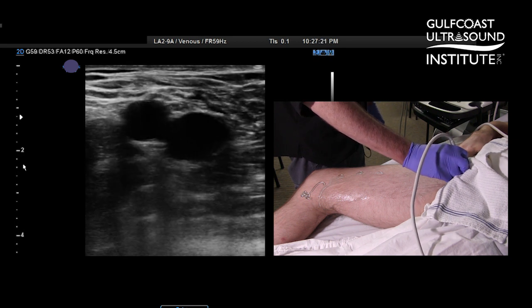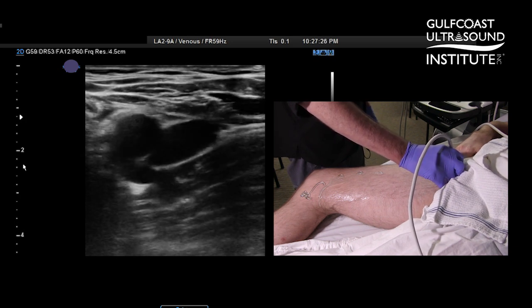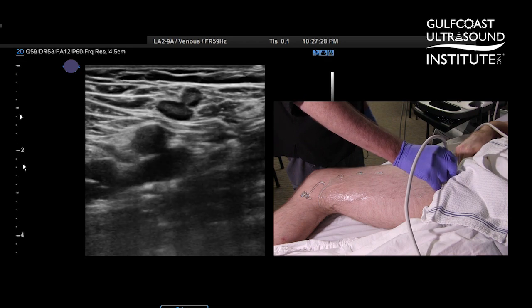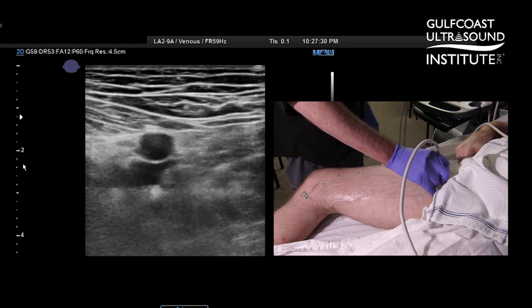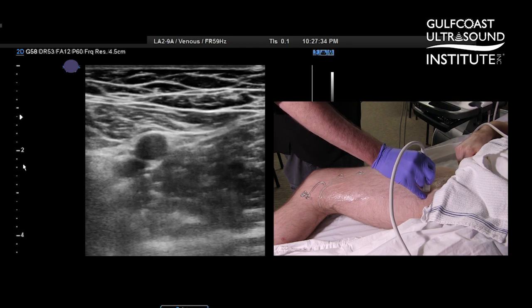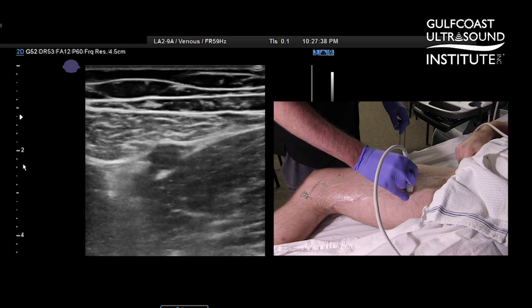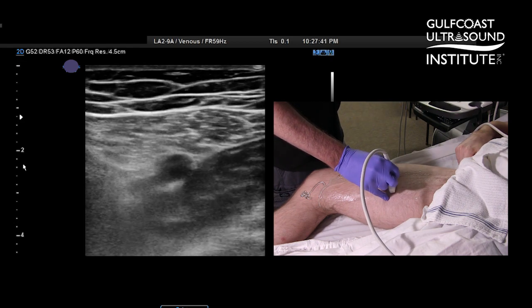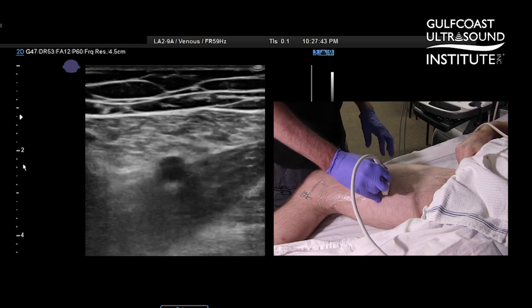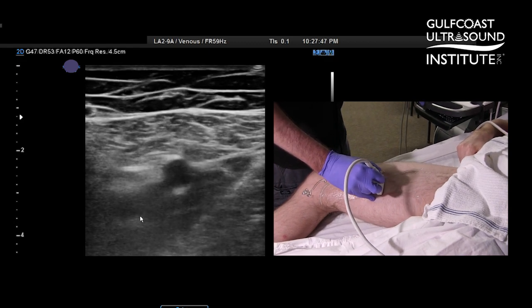That saphenofemoral junction is an appropriate place to start your compressions. So indicator toward the right — compress — there's our saphenofemoral junction. About every centimeter you're going to compress as you come down the leg. We're at mid-thigh, still seeing that vein very clear, still compressing.